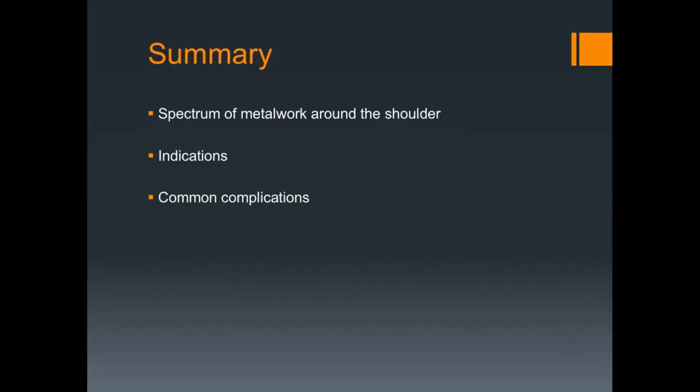Could I just say something? Yeah. Elizabeth, can I just say something? The one thing we sort of maybe just skipped over a tiny bit was shoulder arthroplasty is sort of divided into your fracture ones and your non-fracture ones, and they have their different problems.